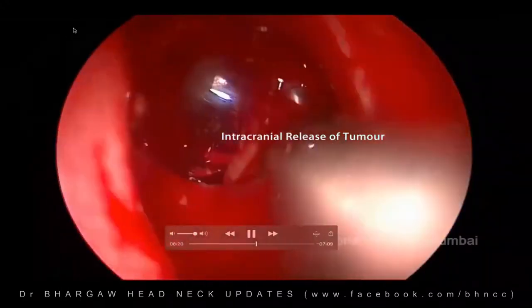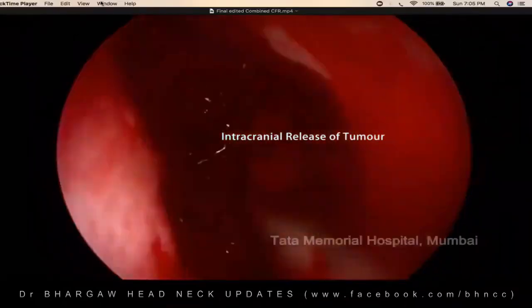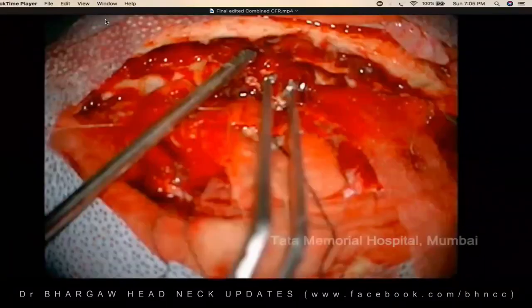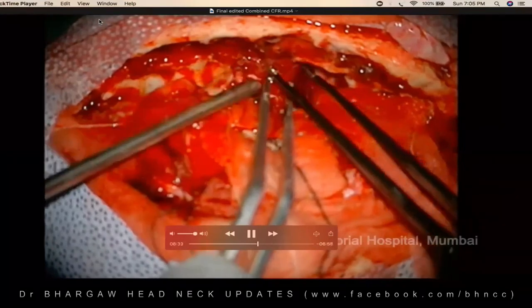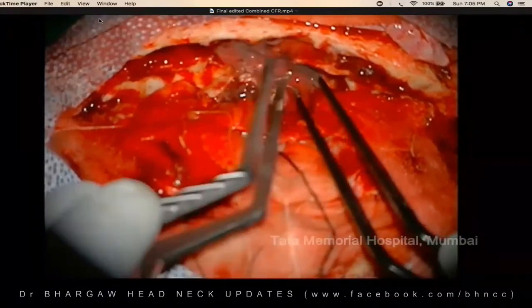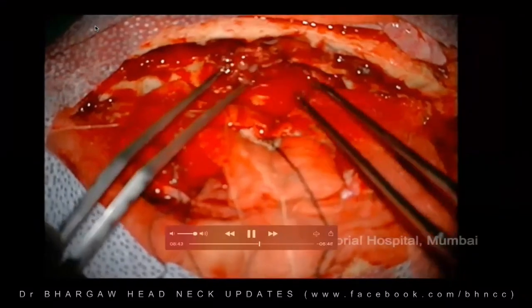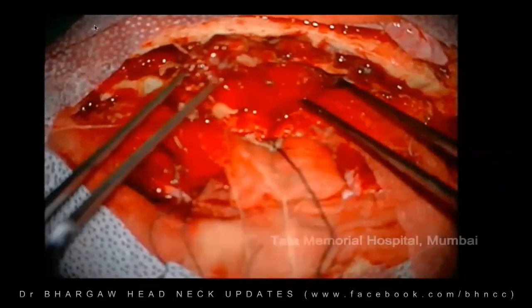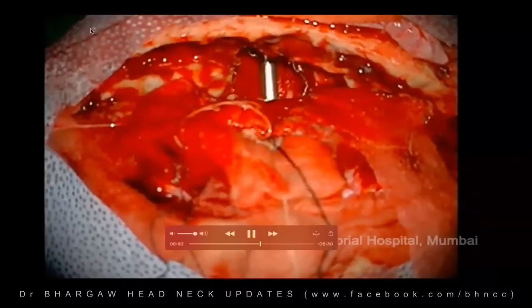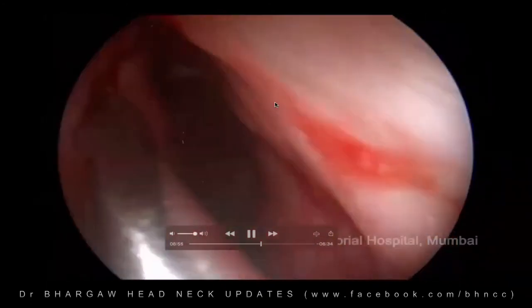Now, as you see there, sorry, it's a very bloody field, but I couldn't help it, that's how it is. Now as it was above, this is another view. The tumor, as we just released it from inferiorly, is being delivered from above. There you go. The tumor is out, and the margins will be taken henceforth. Now superiorly we have got margins on the dura and everything else. So now we need to get the margins from the intranasal part.